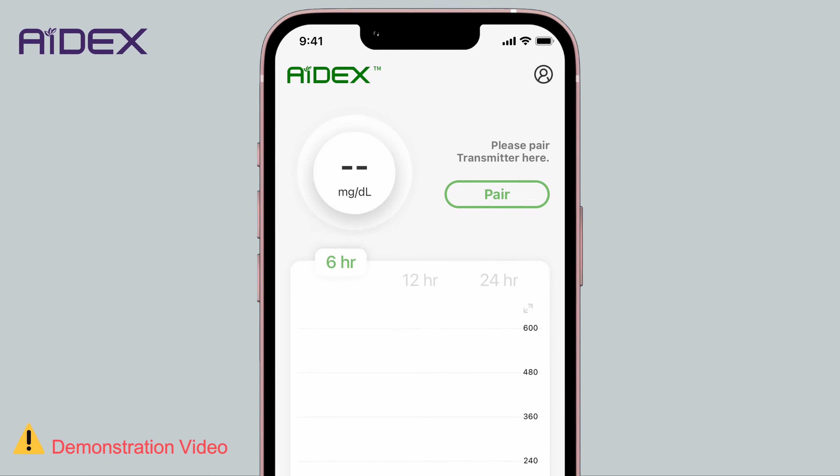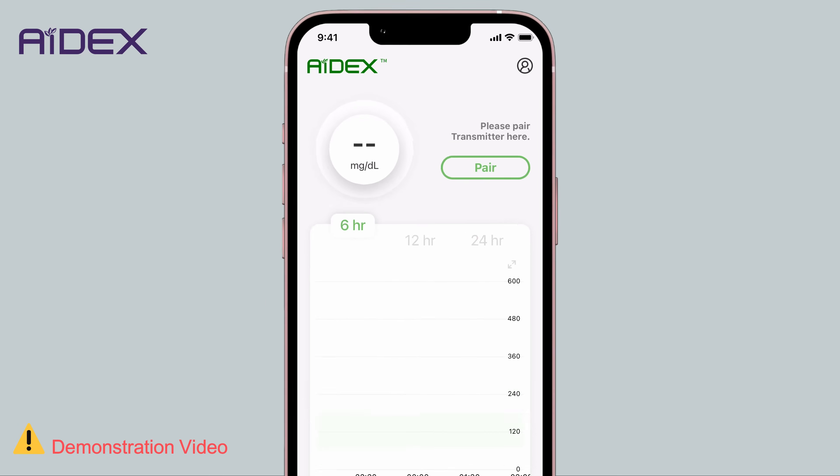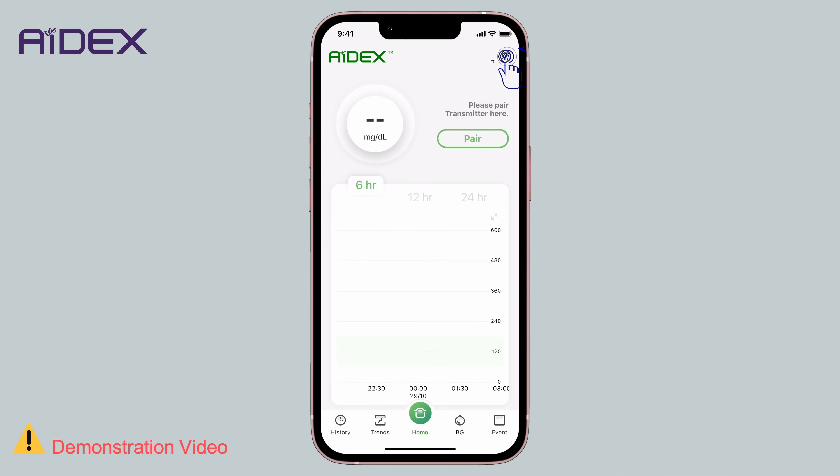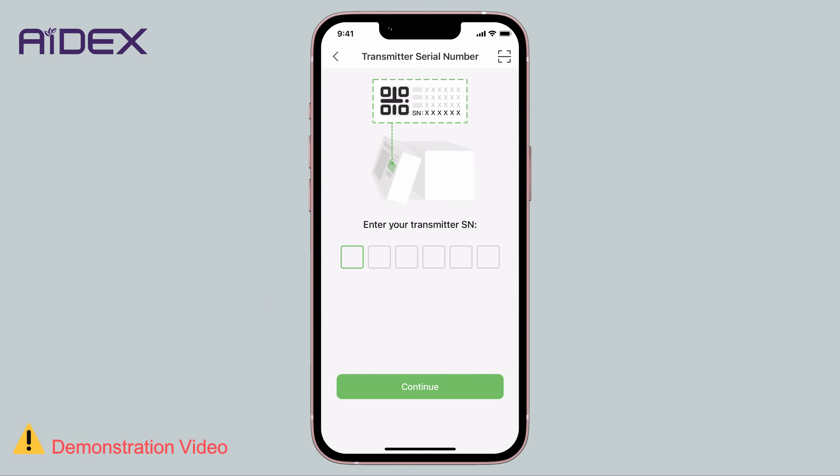If it's your first time pairing, you will find the pairing button on the application's home screen. Alternatively, tap Personal Settings, then Transmitter. Here you can enter the serial number for the transmitter in two ways.